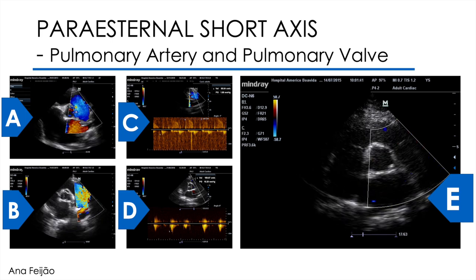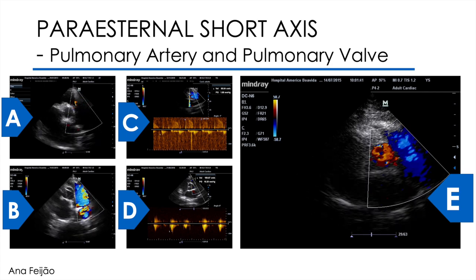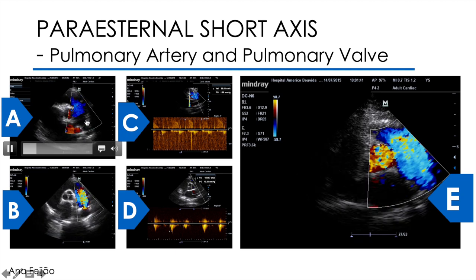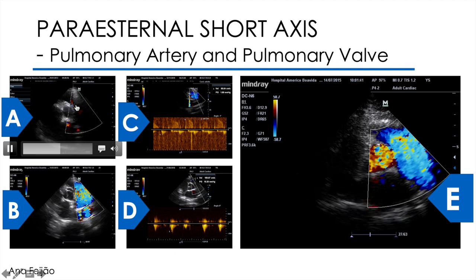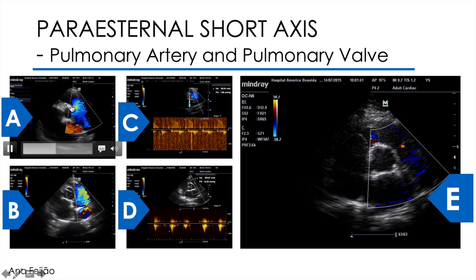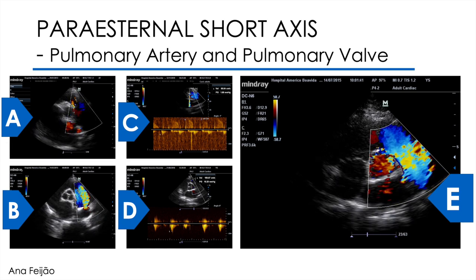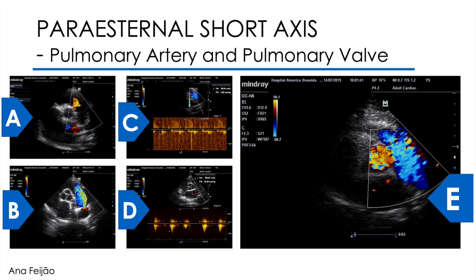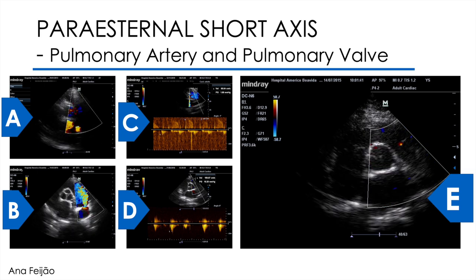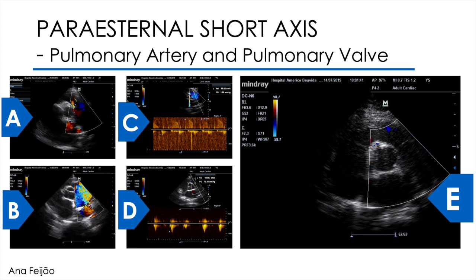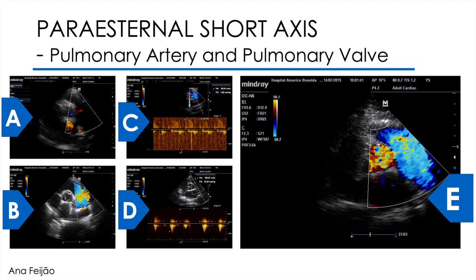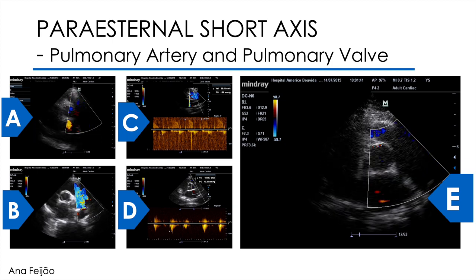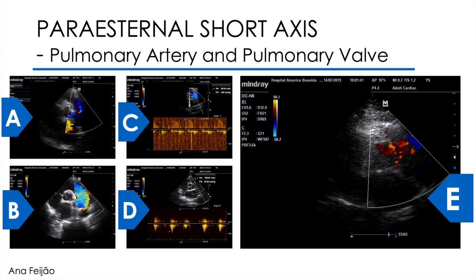After improving the 2D image and color with the necessary commands, we evaluate the systolic flow and diastolic flow well. It is common to find this flame here in diastole, which corresponds to pulmonary regurgitation. The length of regurgitation is directly related to its severity. It is important to bear in mind that to access regurgitation, we must make small tilts on the probe and leave the plane — called off-axis planes. In other words, we leave the plane defined by theory and look for a three-dimensional image of the regurgitation, because the jet can be more exuberant in a plane than the one we are observing. These small tilts allow us to have this notion of three-dimensionality of the flow.